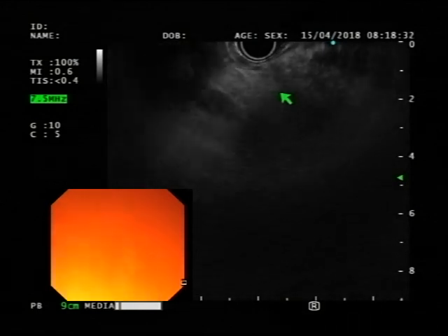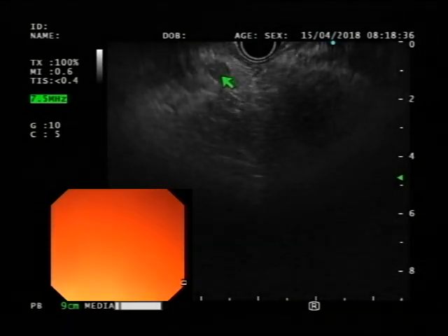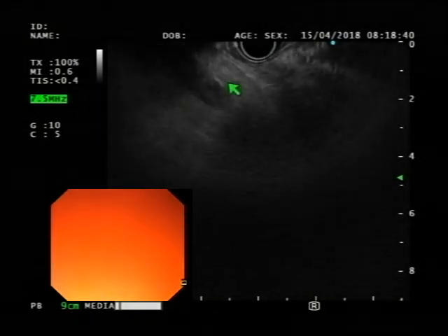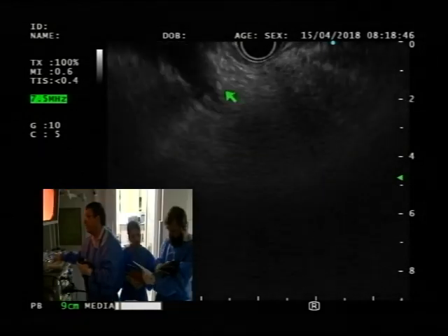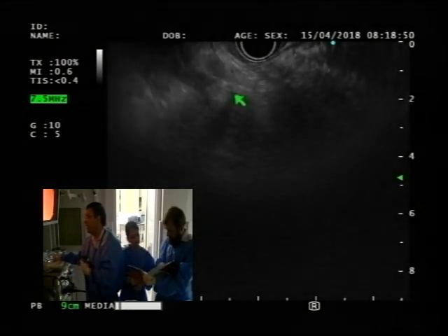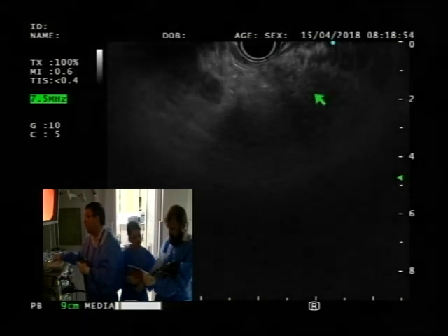Okay. This is just like a chronic pancreatitis. A chronic pancreatitis, and this is the one you are talking about, that's right? That's a very benign looking lymph node. And there was another one too, right there it is, and maybe right there is the aorta, you see that. Lymph node periaortic, close to the hilar area.